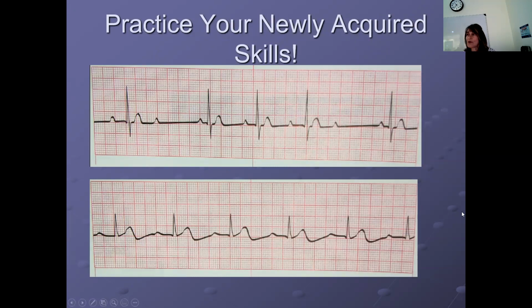All right, so that's it for heart blocks. First degree, second degree, there are two types, and then complete heart block. Let's see if we can look at a strip and figure out what we're looking at. Take a look at the top. We have a rate of 50 per minute. We see a P wave. The PR interval is really long here. Here's a P wave with nothing.